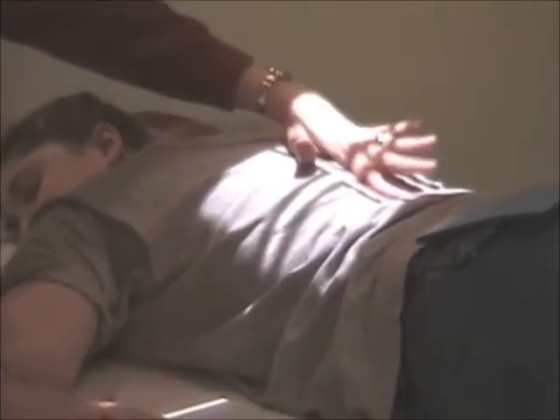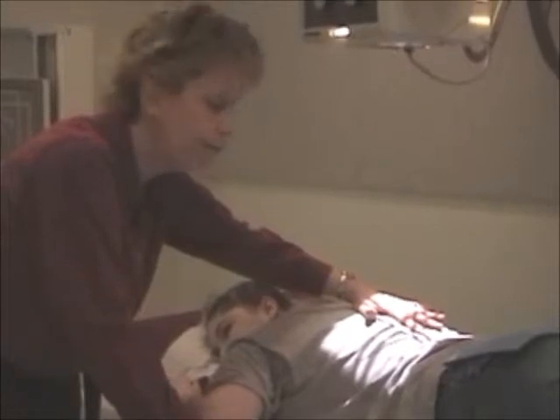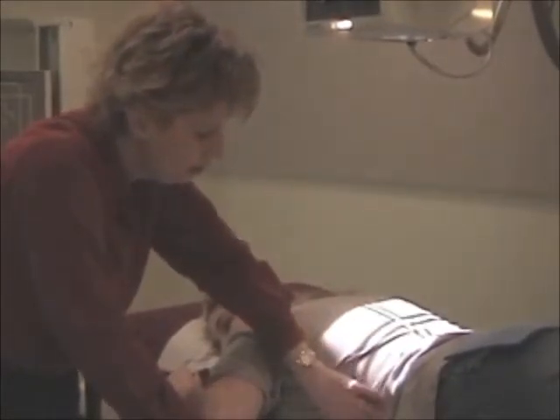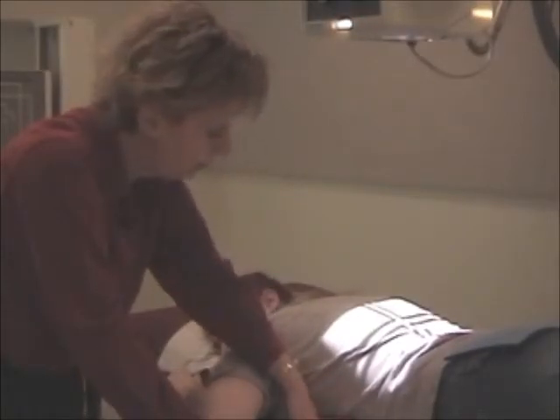And then side to side, here's her spine right here, and I'm 1 inch to the left of the spine. Because again, the stomach is fairly midline. It is on the left side, but just off of midline. So I'm happy with that placement. Then I like to look at the edge of the body here and make sure I'm not X-raying tabletop.